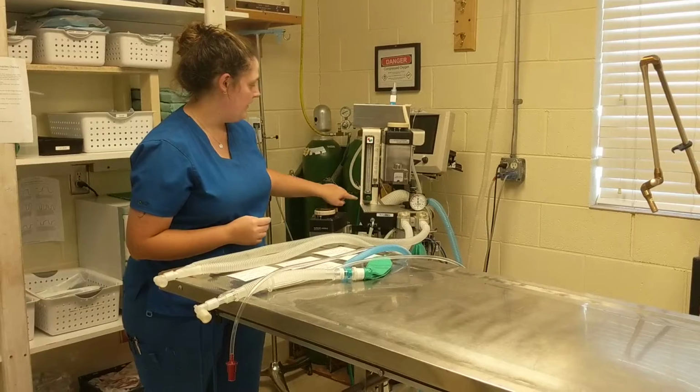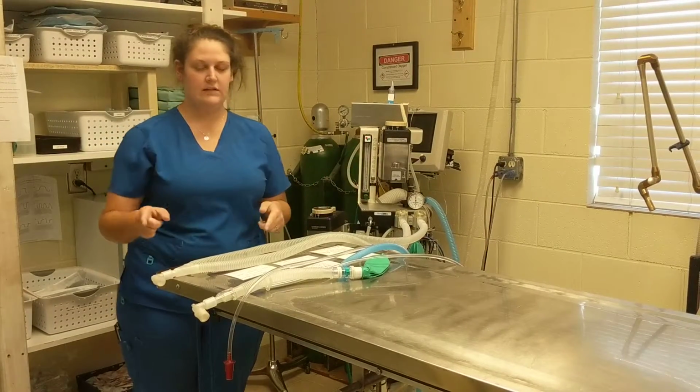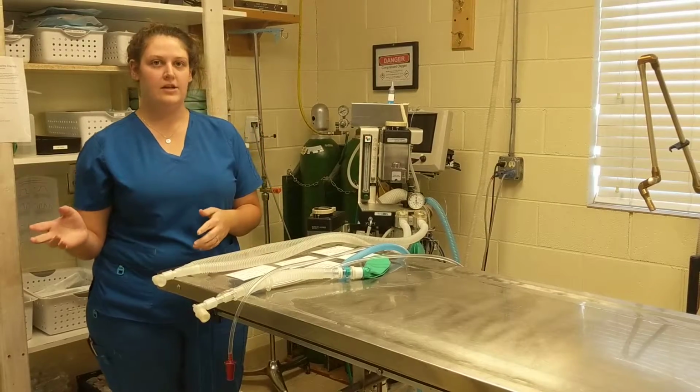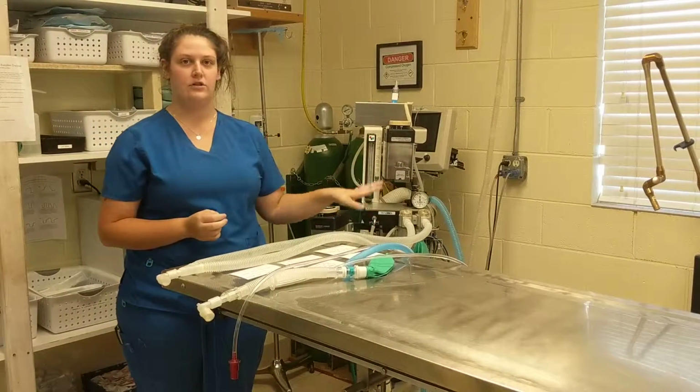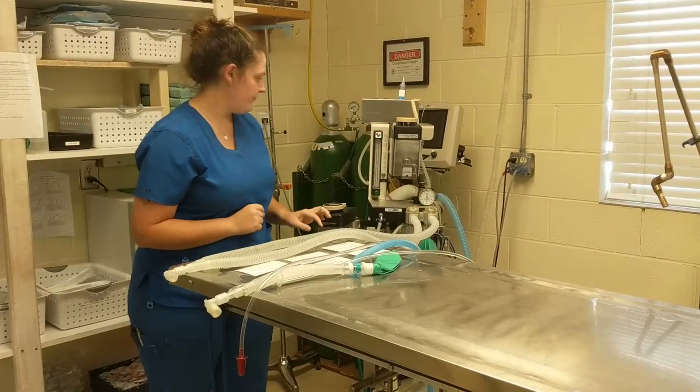Next we see this flow meter goes into our flush valve. This flush valve flushes through the system and lets us go in between each patient and get rid of excess drug and oxygen from the previous patient, like so. It goes out this line.